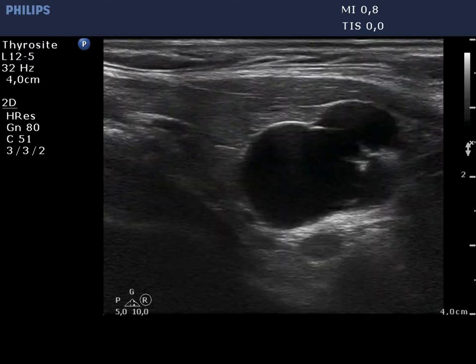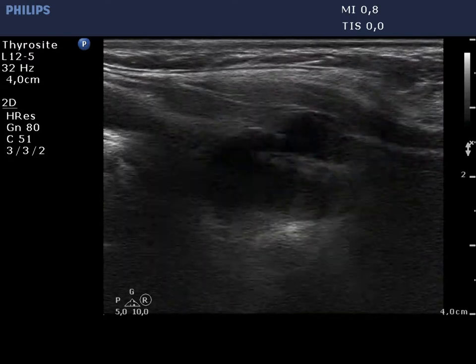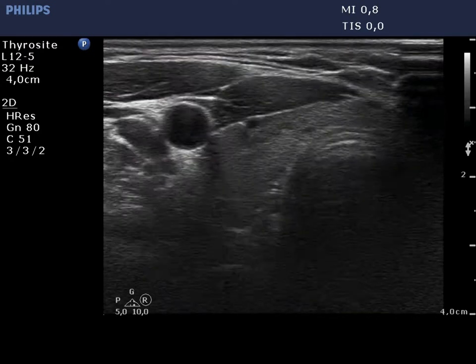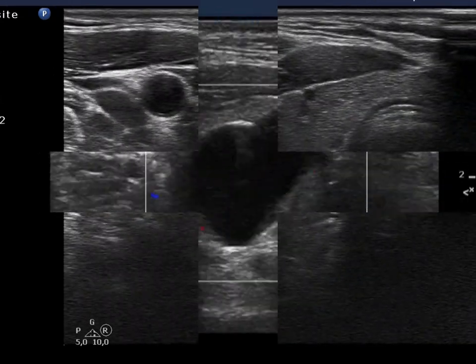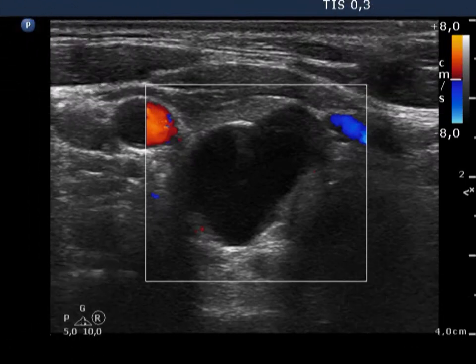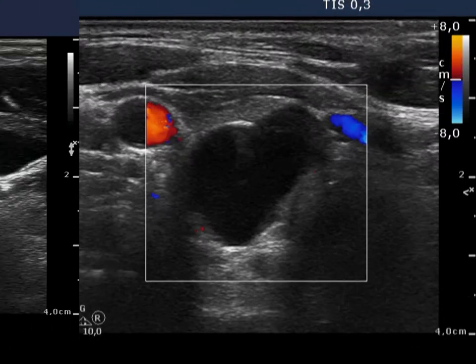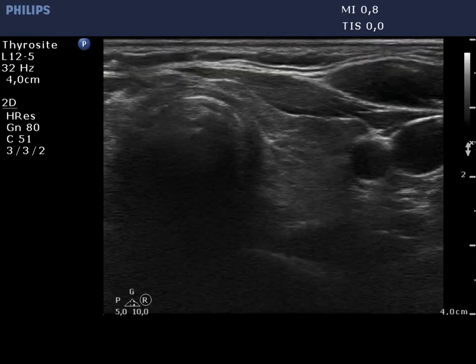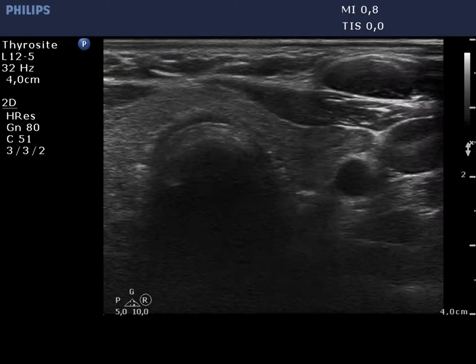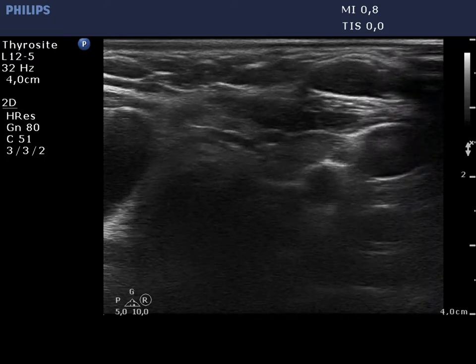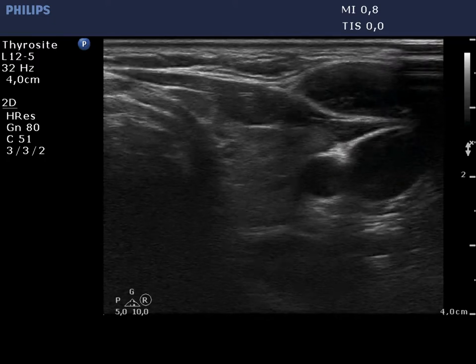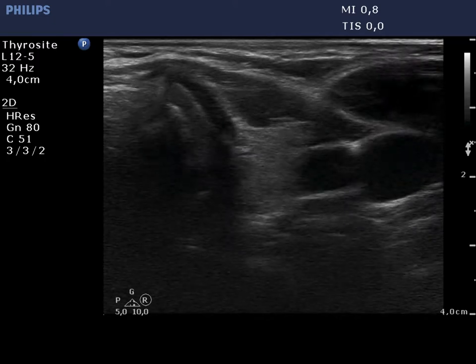Longitudinal scan of the thyroid and now the parathyroid cyst. The lesion presents a type 1 vascular pattern. The left thyroid has a similar presentation.